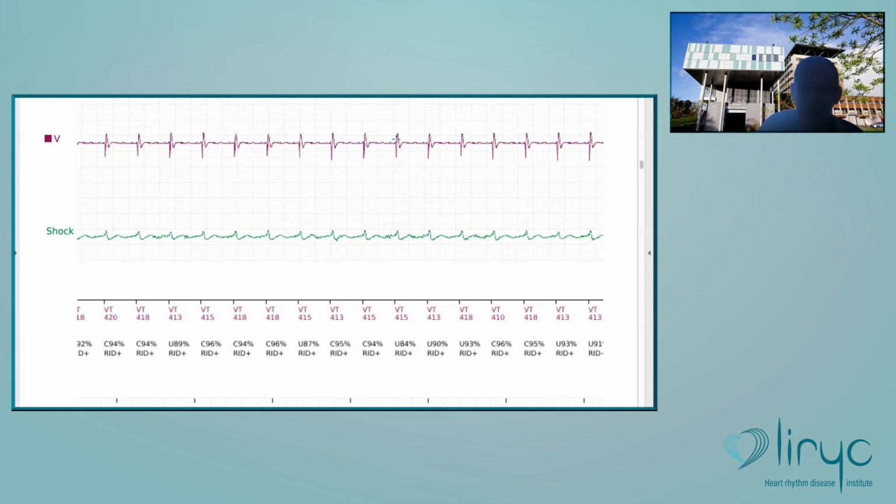In the old versions, on all the platforms of Abbott devices, it has been modified in the new ones. And obviously, when you look, I thought it was the same pattern as Boston, but it's not exactly the same.